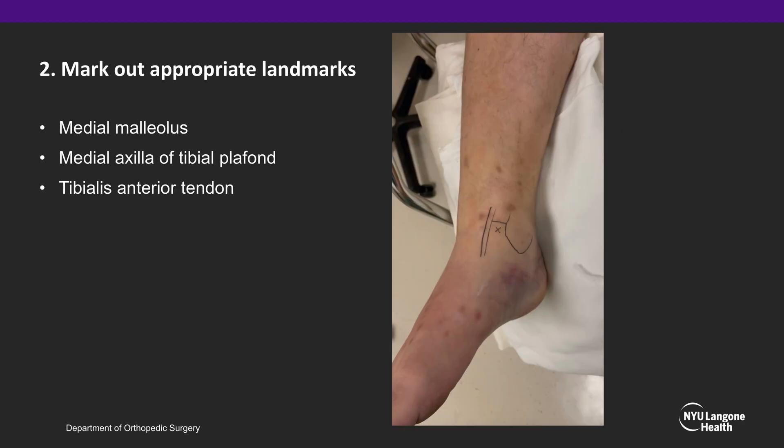Mark out your appropriate landmarks. We prefer to trace out the medial malleolus, the medial axilla of the tibial plafond, as well as the tibialis anterior tendon. In between those structures, you can palpate the soft spot to the anteromedial ankle, as displayed here.